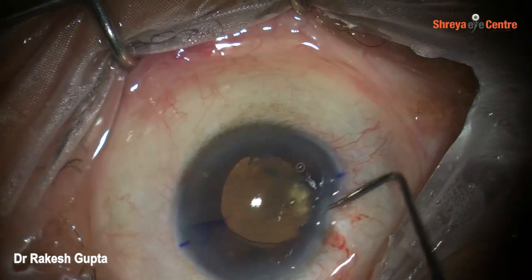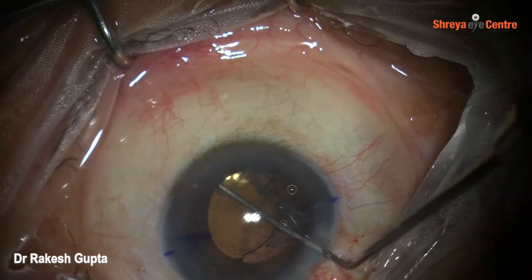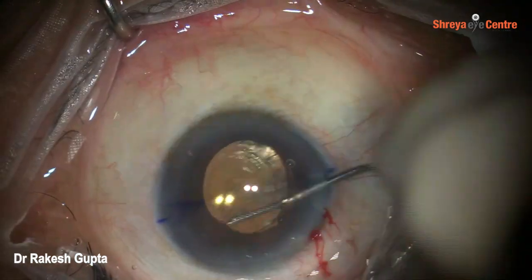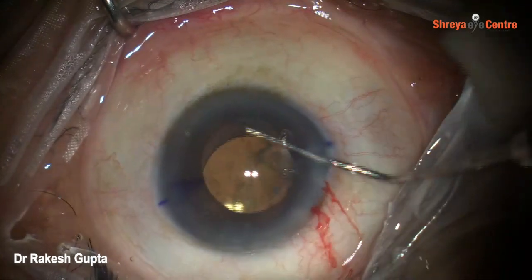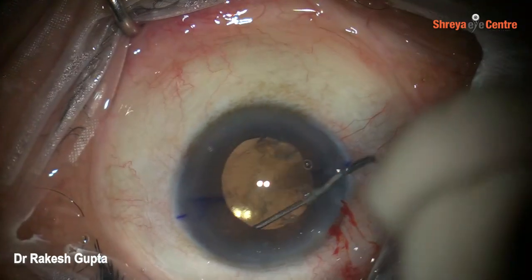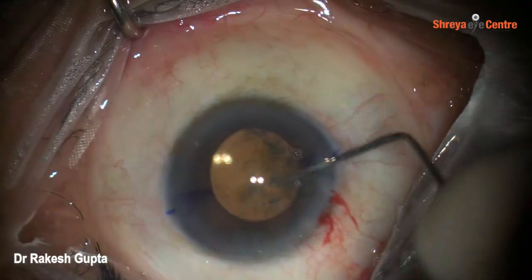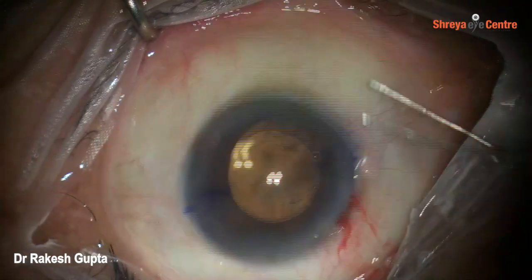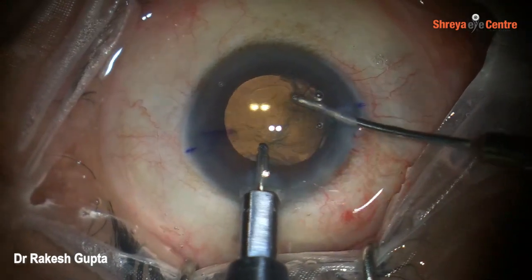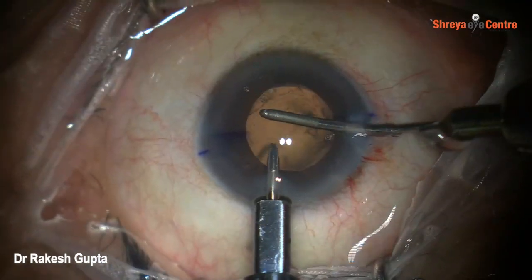You can see now that the lens is very well inside the bag, and because this is a toric lens, I'll be rotating this lens. You can see with gentle maneuvers I've been able to place the lens appropriately at the right axis. And now you can see I am removing the remaining cortex. This is the cortex in the area of the PC tear. And you can see the lens is very well centered in the bag behind the anterior capsule.